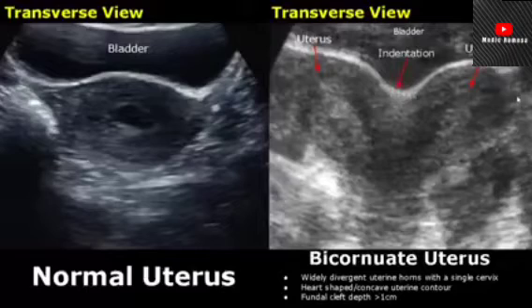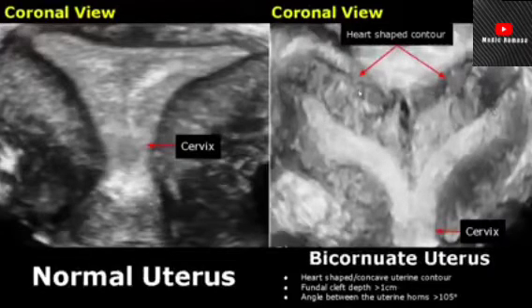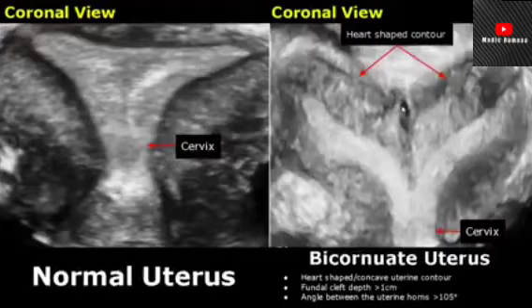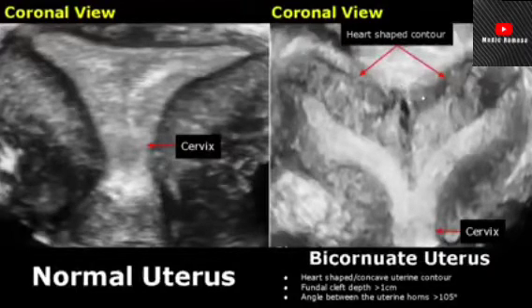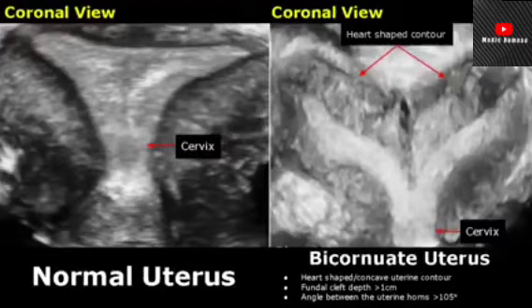On a 3D coronal view of a bicornuate uterus, we can clearly see a heart-shaped uterine contour. The fundal cleft has a depth greater than one centimeter, and the uterine horns are widely divergent. The angle between the uterine horns is obtuse, greater than 105 degrees, and both uterine horns are connected to a single cervix.